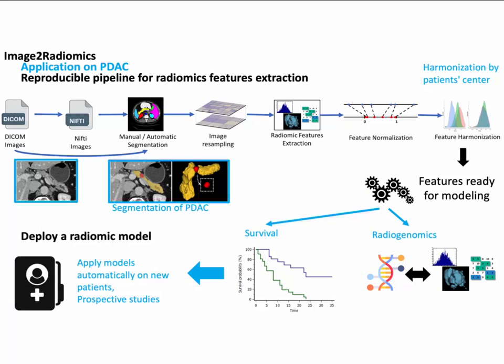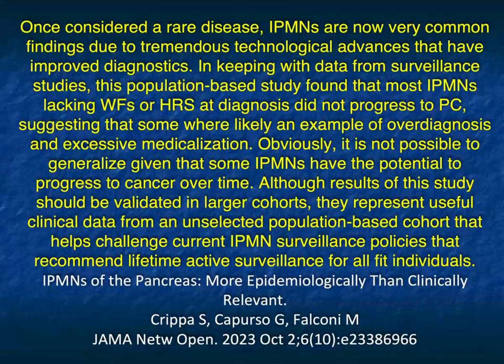So we want to build this into a flow chart where there's little involvement by the radiologist, because if you want to screen all patients coming through, you need to have the computer be doing everything, and only at the end, when it's abnormal, will the radiologist get involved.